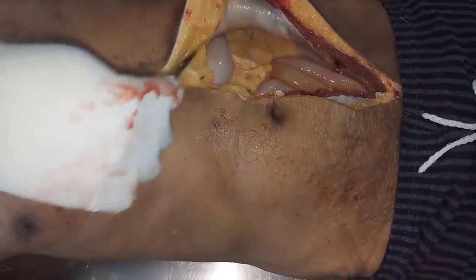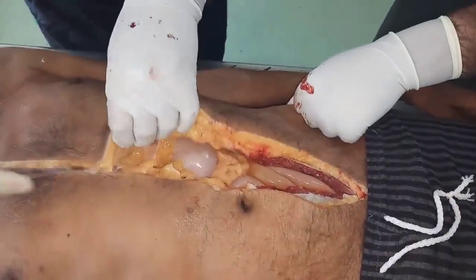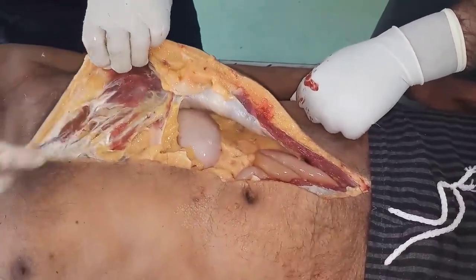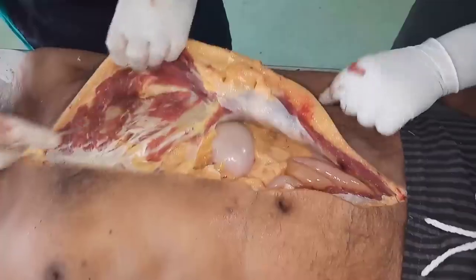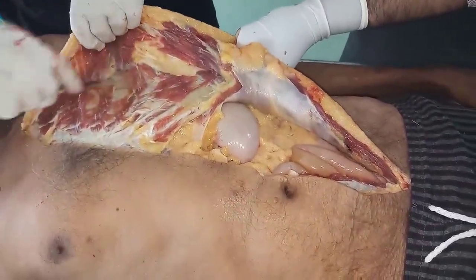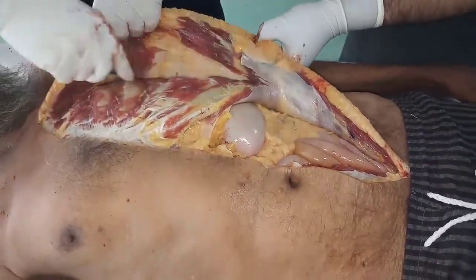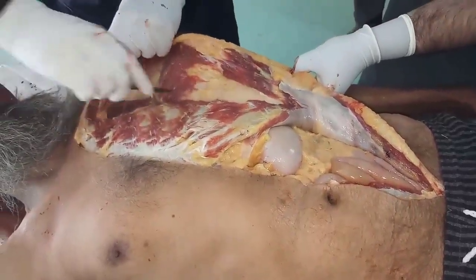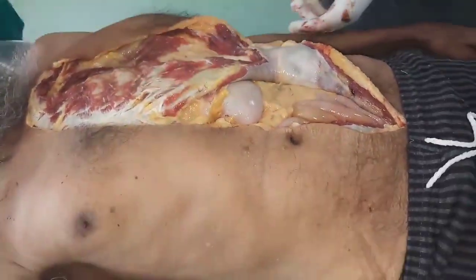Okay, now I will remove the structures over the chest. So you can see these chest muscles, pectoralis major, latissimus dorsi on the side. We'll just lengthen this incision from here for easy dissection. Now the same thing we will do for the other side. Another side.